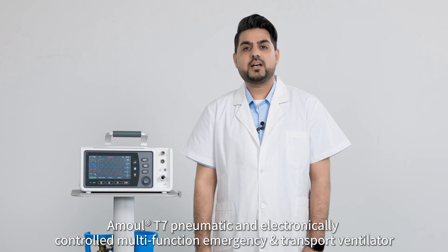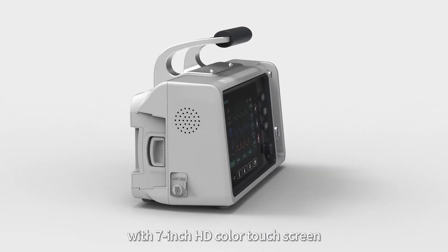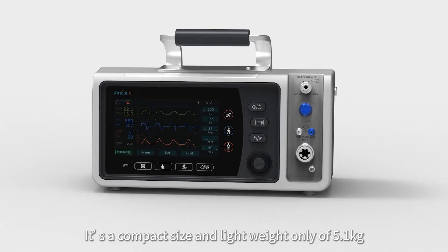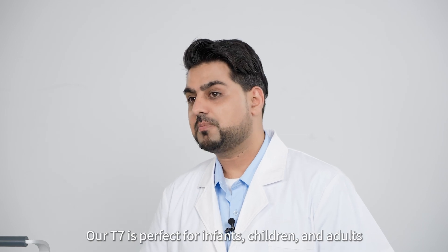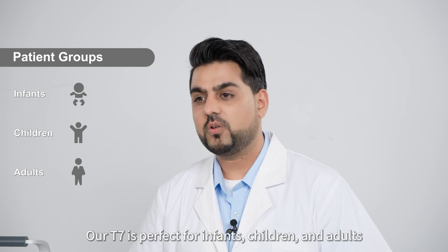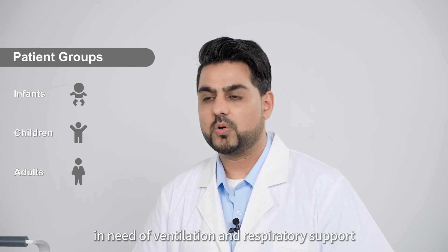Amol T7 pneumatic and electronically controlled multifunction emergency transport ventilator with 7.8 inch HD color touchscreen. It is compact in size and lightweight, at only 5.1 kg. Our T7 is perfect for infants, children, and adults in need of ventilation and respiratory support.